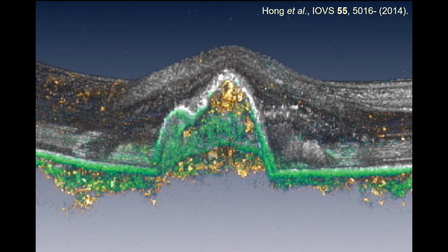Which kind of information can we obtain from clinical cases by using the Jones matrix OCT? Here is an example of a case of PCV. In this image, the OCT appears as gray, and the melanin, which is the information extracted from the polarization, appears as green.